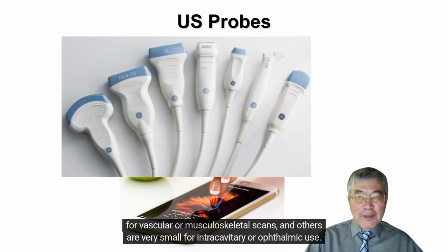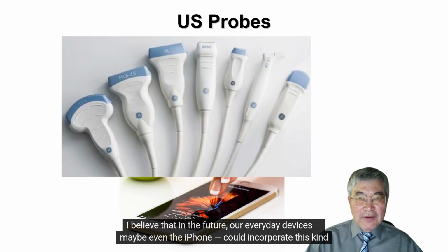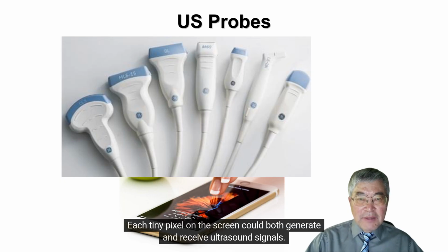Now, I'd like to share a more forward-looking idea, something I've been thinking about for quite a while. I believe that in the future, our everyday devices, maybe even the iPhone, could incorporate this kind of piezoelectric technology directly into the screen. Just imagine that the phone's surface could act as a two-dimensional acoustic transducer array. Each tiny pixel on the screen could both generate and receive ultrasound signals.